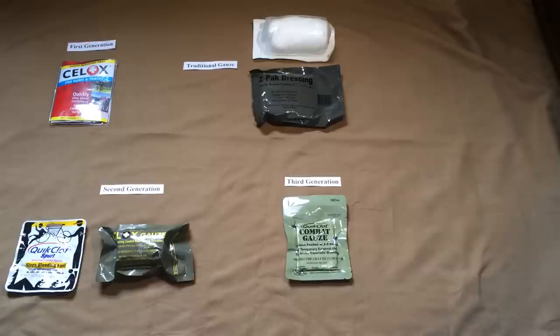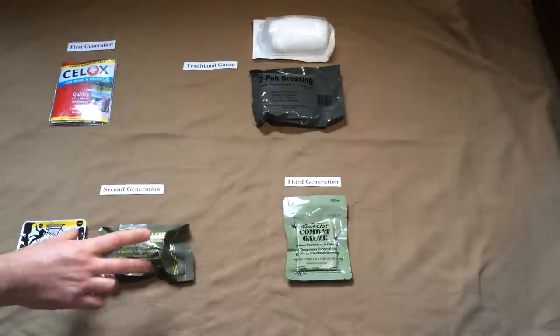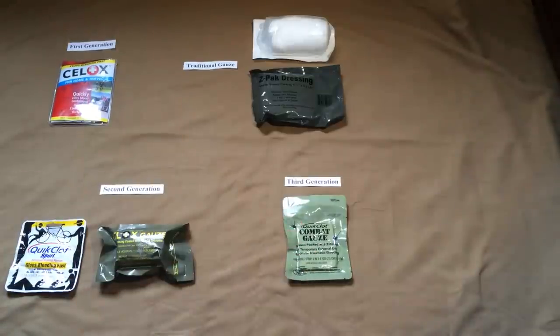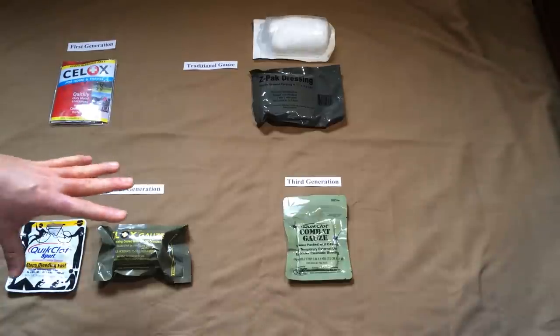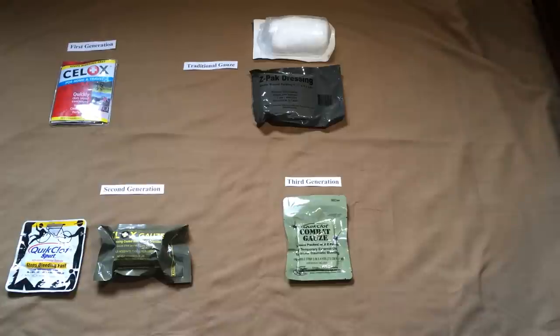I've also listed company website product information sheets as well as instructions on how these are applied. One quick thing to point out: I did see one study on the third-generation Celox Rapid noting that chitosan apparently has an antimicrobial quality — it basically disrupts the membranes of gram-negative bacteria. That's a little different from the rest; the others are focused on controlling bleeding, but chitosan also appears to be at least somewhat effective against gram-negative bacteria.